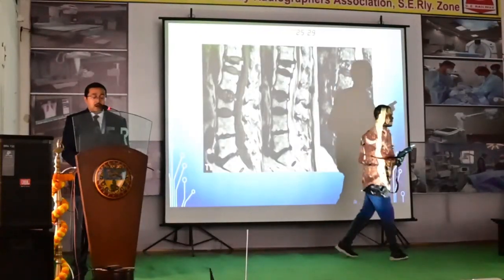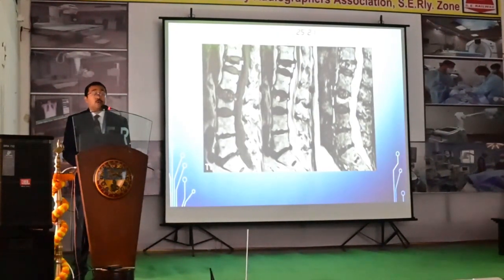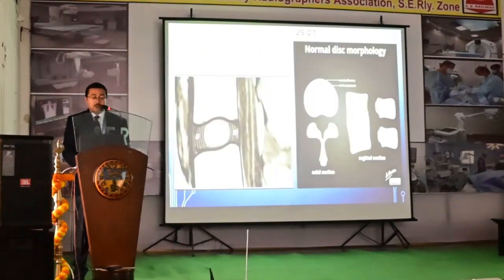Another case, also in T1, T2 and STIR. STIR is a fat suppressed technique. You can identify in the STIR image that the fat is suppressed here. In T1 and T2, in both images the fat is hyperintense. And here also the problem is multiple vertebrae; this is the vertebra plana, and this also has reduced vertebral height centrally with central wedging and degenerative changes.